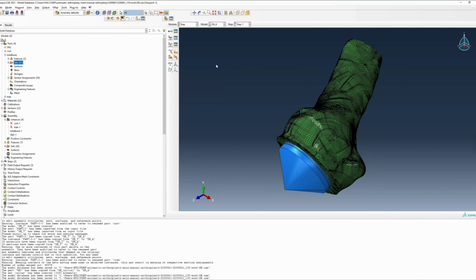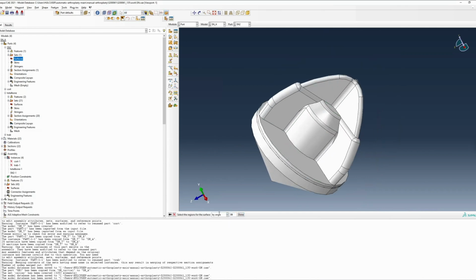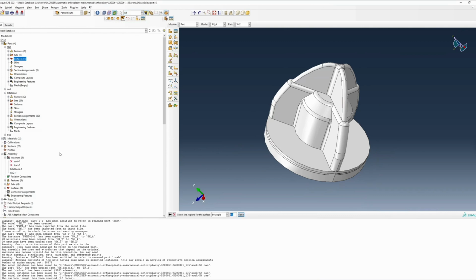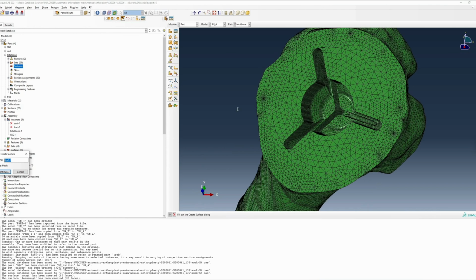Once you've completed your step settings, we can move on to our interaction properties module. This can be very specific to your own analysis, but as an example, I'll show myself assigning 2 different contact interactions for different spots across my implant. Begin by assigning surfaces to all of the relevant geometries of your implant. Next, assign surfaces to the mating counterparts on the bone model.